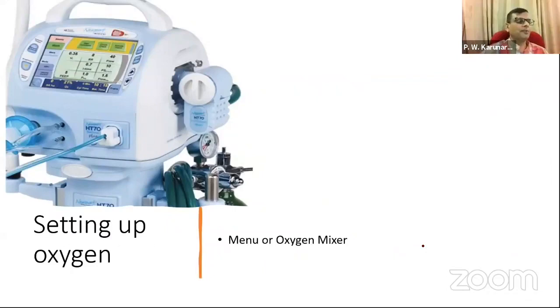So first of all, setting up the oxygen. If it is not available in a menu on the ventilator touchscreen or any other menu, maybe look at the side of the ventilator. This is actually a Newport portable ventilator where you have an oxygen mixer.